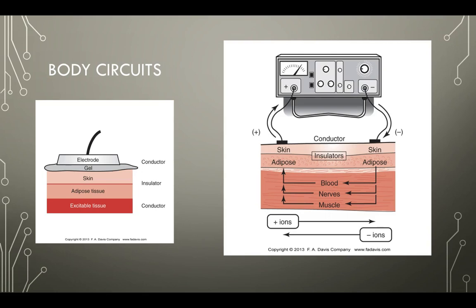Internal organs actually have a decreased resistance. So the heart itself. When we talk about not wanting to put the electrodes directly to the heart, it doesn't have as much to do with the heart muscle fibers itself. It has more to do with the electrical stimulation points, like the carotid sinus and those electrical points, than it does with the heart muscle itself.